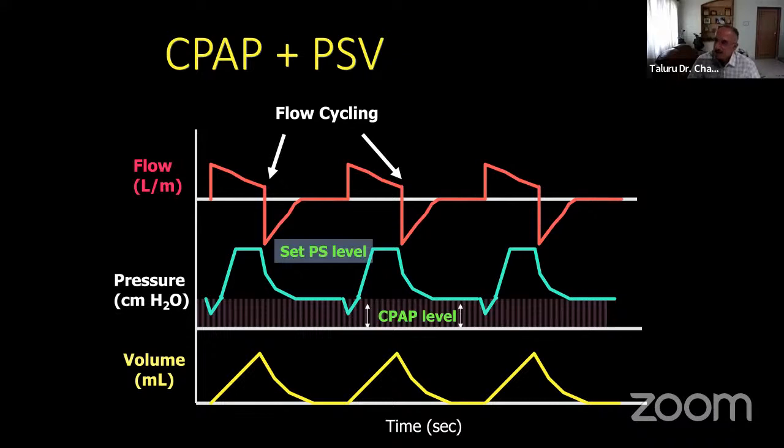The only application I would think of is during induction: if you don't have a ventilator, you can tighten your PEEP valve so that the air stays back and the FRC increases. Otherwise, PEEP in pressure support ventilation we call the PS PEEP mode, pressure support PEEP mode. When you just plainly use PEEP in a spontaneously breathing patient, we call it CPAP.